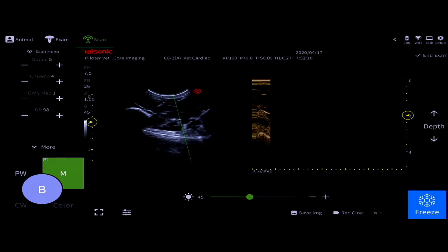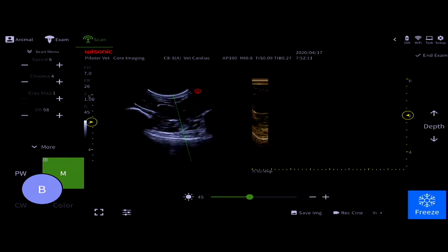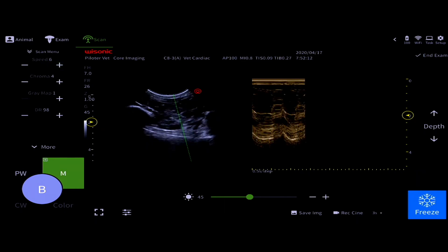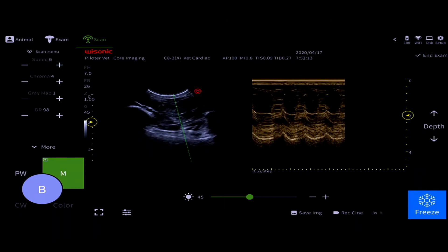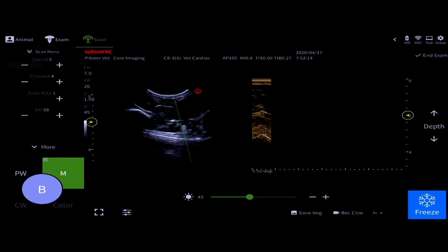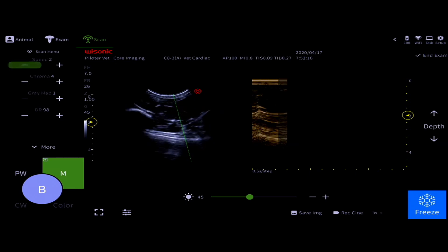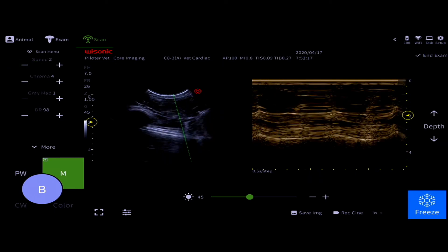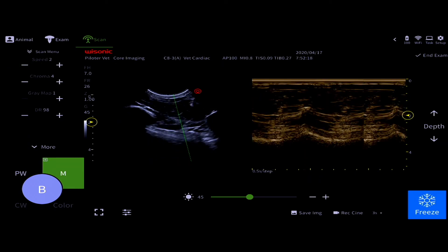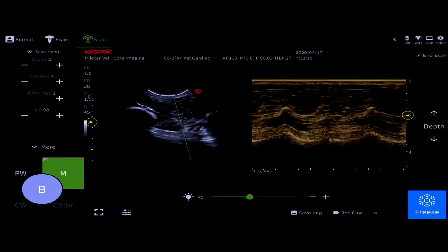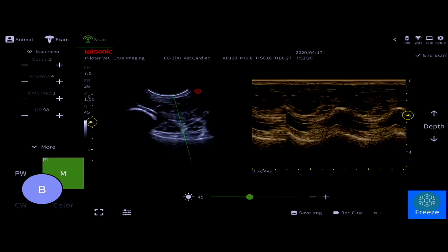On the left-hand side, you're able to change any of the parameters of the M-Mode to get it precisely where you need it to be for your calculations. Once you have it where you need it to be, press freeze.